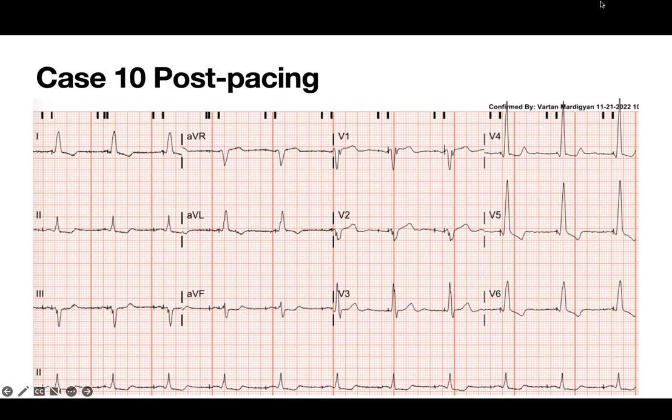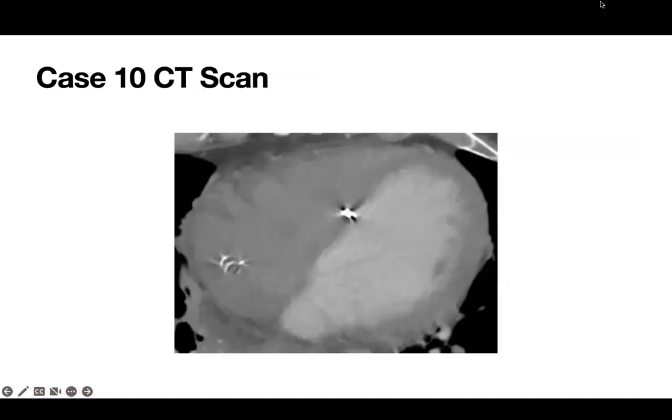The other question is, when you get this, are you going to go to CRT and put a CRT in? But the guy's EF was 50%. I think there's no point to do that. And this guy had a random CT after for another reason too. Jackie, can you go to the next slide? It's really at the endocardial surface. I think you couldn't have gone more than that, but probably he has some disease of his ventricle and endocardial surface that makes getting to the left side take longer. And no matter what you do, you're not going to get a narrow QRS in these cases.